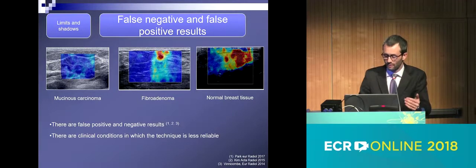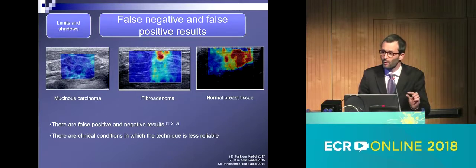And there are clinical situations where the technique is less reliable because it's difficult to get a reliable image. Especially in very small and dense breasts, sometimes you get stiffness that does not really reveal a real lesion.